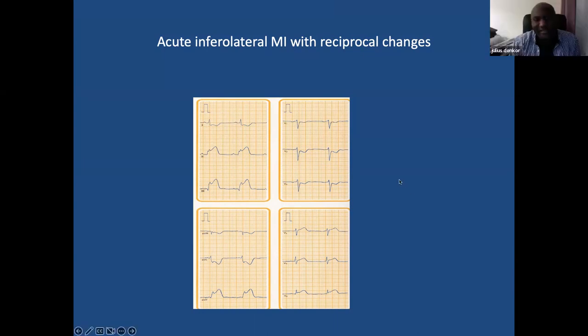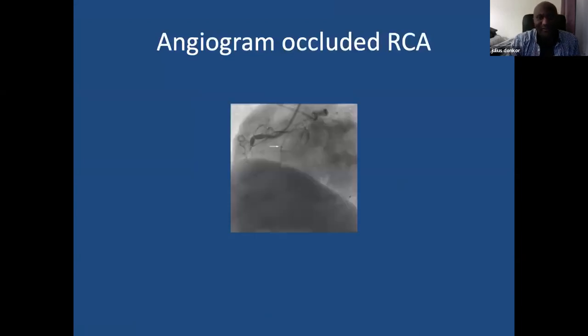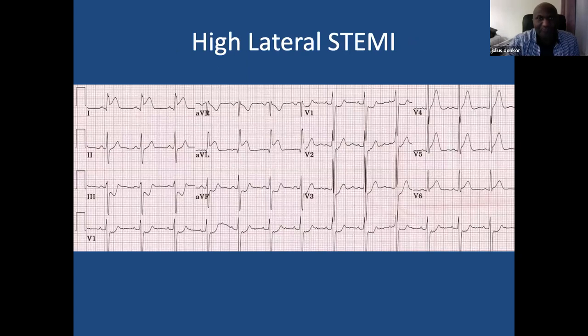You agree with that, Dr. Daffy? The artery is dominant, so it goes beyond the crux of the heart. Yes. So that explains it for us. Excellent. Right, let's move on. That's the right coronary artery, quite proximal. Right. Okay.